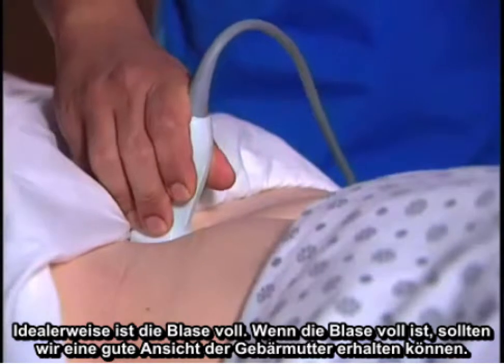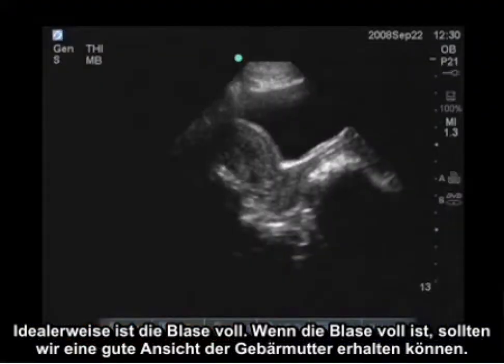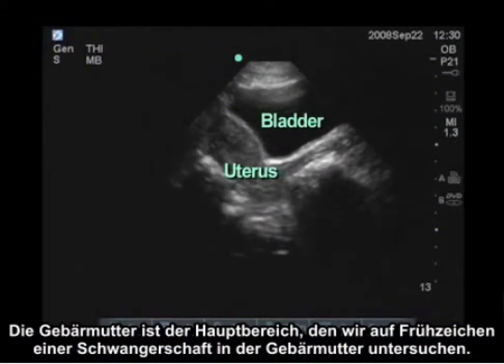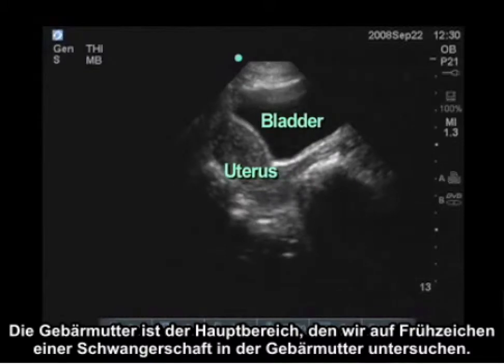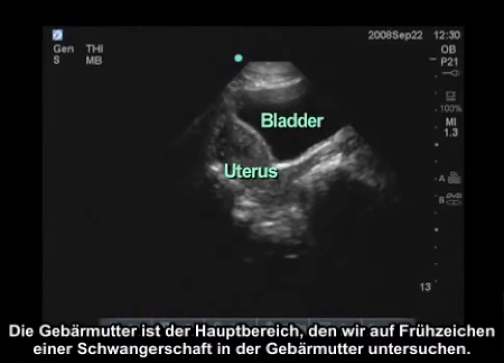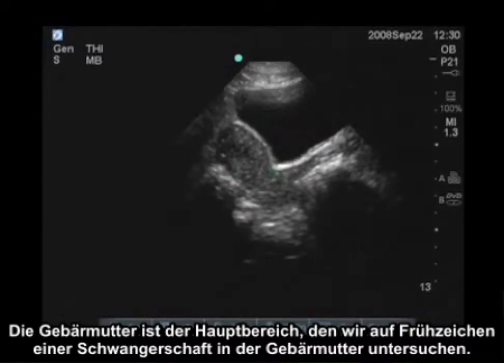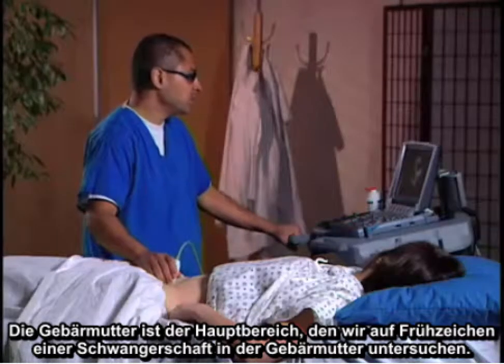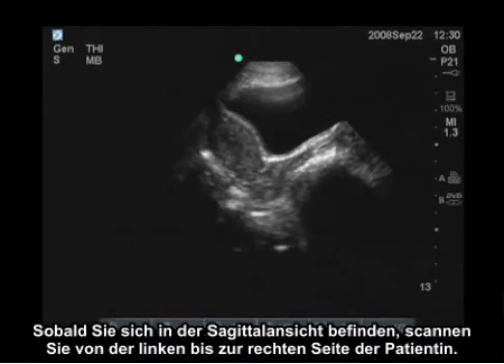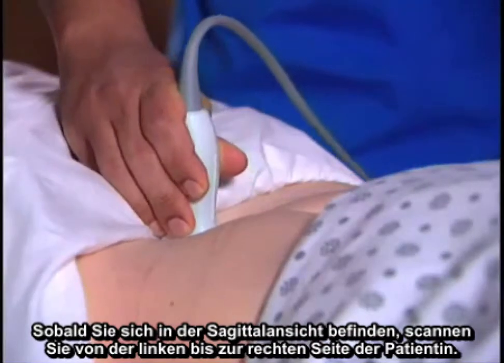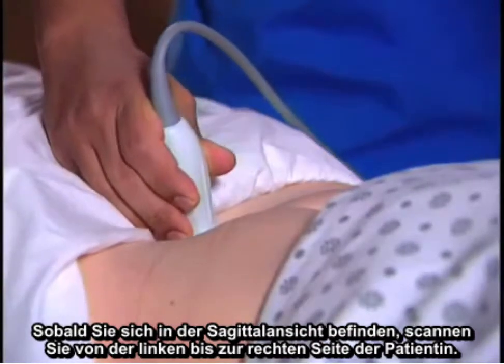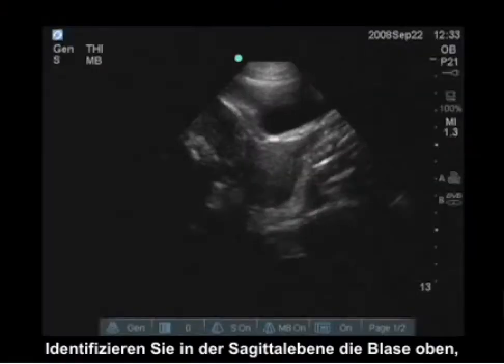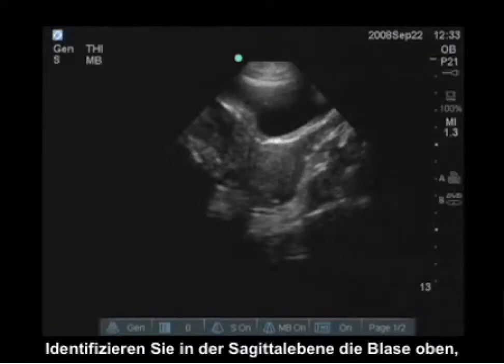Ideally the bladder is full. If the bladder is full, we should be able to get a good view of the uterus. Through the uterus, it will be the key area we're going to interrogate and look for early signs of an intrauterine pregnancy. Once we're in the sagittal view, we're going to scan from the patient's left to right.